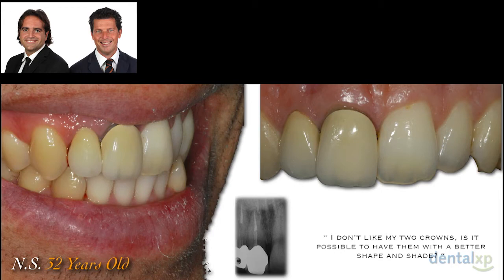First thing to do, collect all the information that is possible. So starting with taking pictures from different angles, evaluating the X-rays, speaking with the patient. And of course, you can clearly see that we have several aesthetic issues, from gingival asymmetries. We have gray.